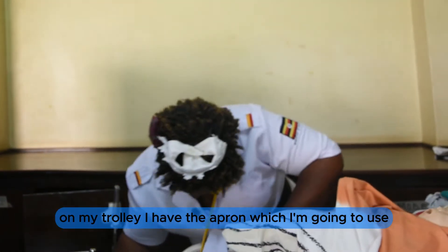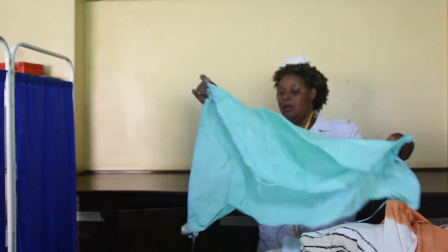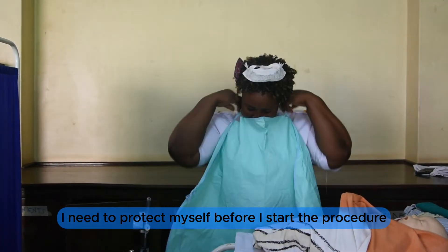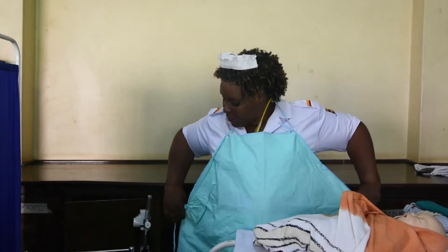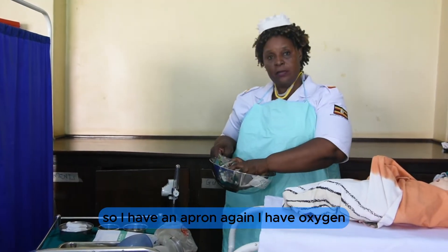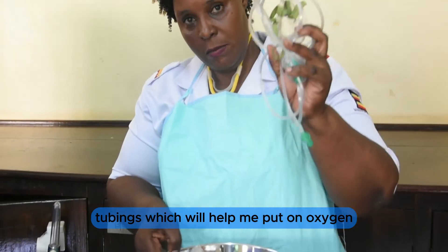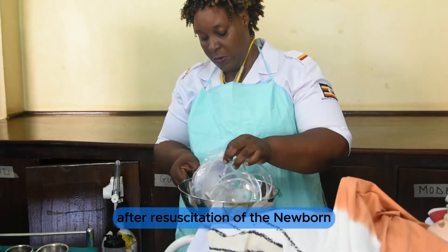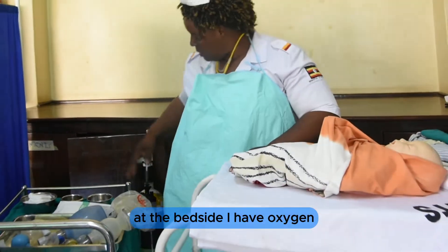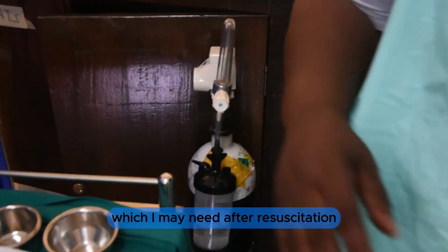Again on my trolley, I have an apron which I am going to use. As a nurse, I need to protect myself before I start the procedure. I also have oxygen tubings to put on oxygen after resuscitation of the newborn. At the bedside, I have oxygen which I may need after resuscitation.